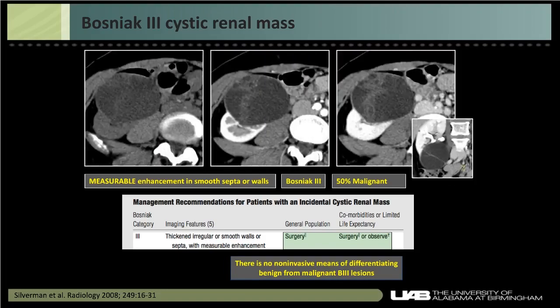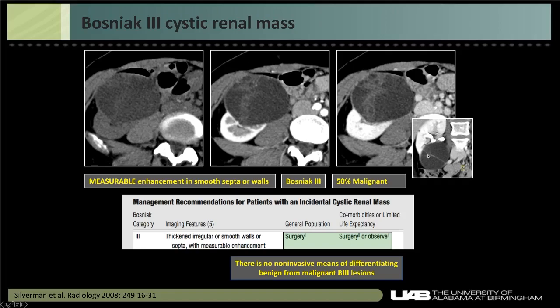Another Bosniak 3 example: the cystic nature is confirmed first, then thin septations that appear to volume-average on coronal view can still show measurable enhancement — for instance, from 22 to 52 Hounsfield units. That enhancement classifies it as Bosniak 3. Careful evaluation on coronal and axial views is needed to assess septation thickness and enhancement.